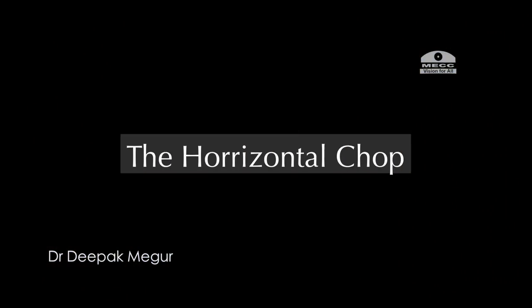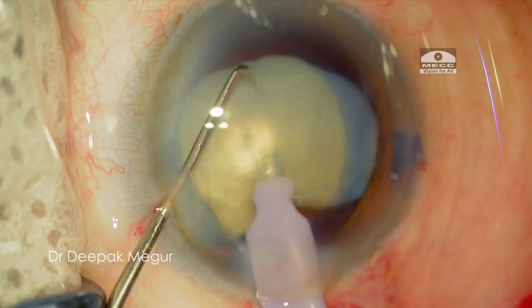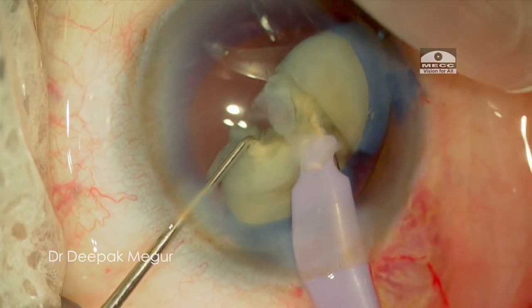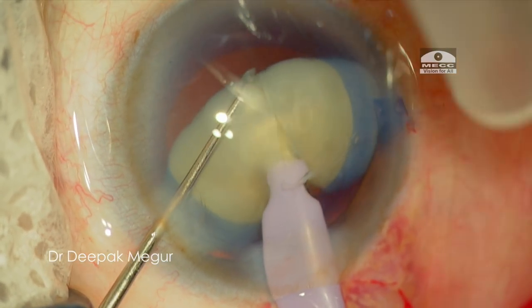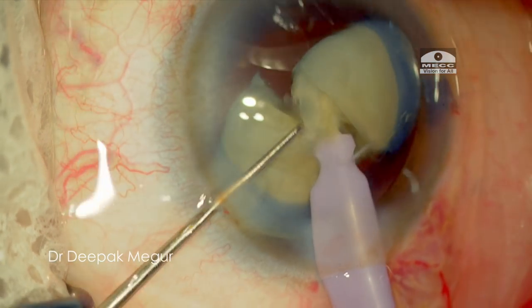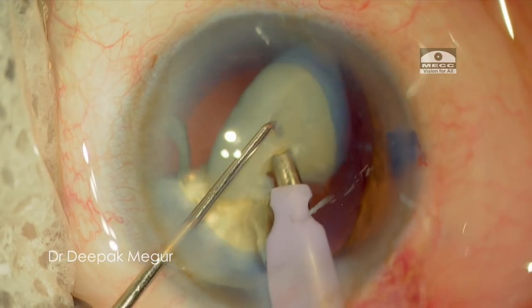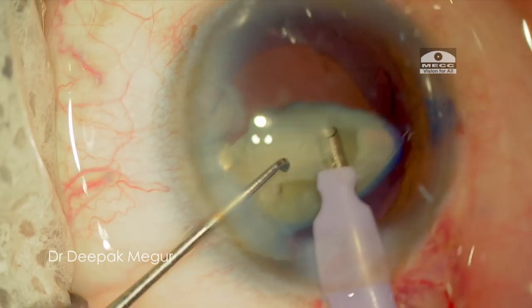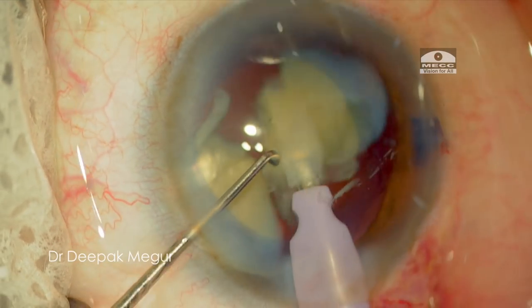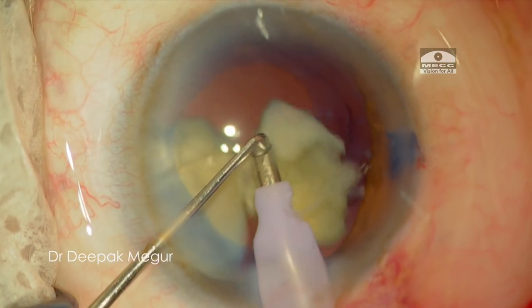For the second piece, I'll demonstrate the horizontal chop. It's easier to perform the horizontal chop on the second heavy nucleus as we've got enough space and can see things much better. The chopper hooks around the equator of the nucleus and then it is pulled towards the phaco tip, giving a full thickness crack quite effortlessly. Well, then why did I not use it as my primary chop? The reason is horizontal chop is slightly risky with a large bulky nucleus with an empty bag, since the chopper has to hook around the equator of the nucleus and it is too close to the posterior capsule for my comfort, especially with a totally empty bag as in this case.